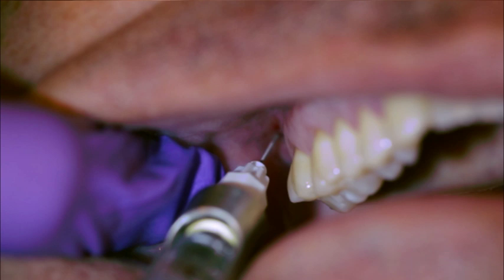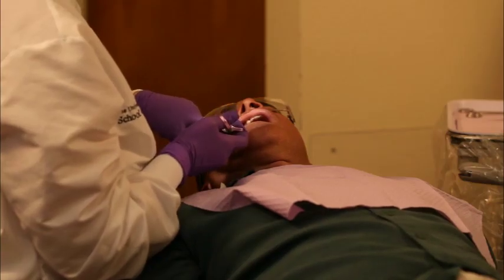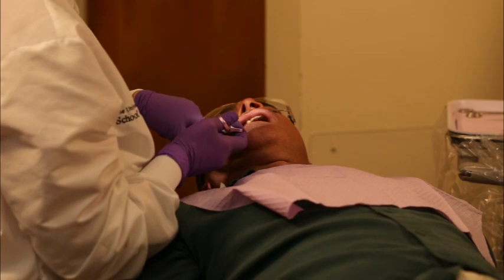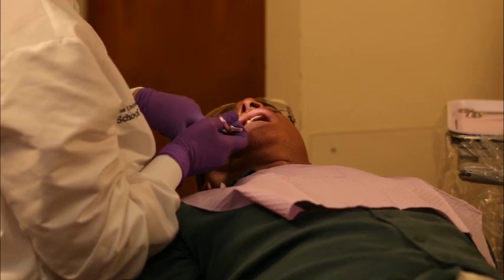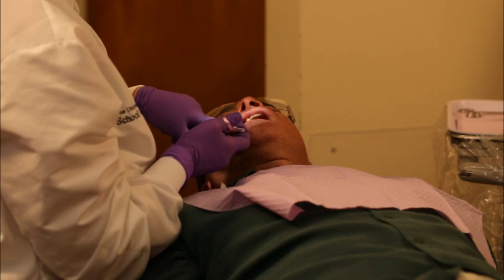If you contact bone, the syringe angulation is greater than 45 degrees backward, which causes the needle tip to be too far medial. To correct, remove the needle completely from the mouth and reposition the angle, decreasing it to 45 degrees. Due to the high vascularity in the area of anesthetic deposition, aspirate 3 times within different planes to ensure that the bevel of the needle is not abutted against the interior of a blood vessel, providing a false aspiration.